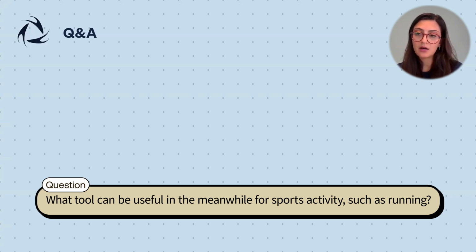The same protocol is also valid for cycling. Someone was asking if it can be used for bicycles. So yes, you can use it in indoor cycling, and you can also measure the activity of the muscle while pedaling. You place the sensor on the pedal of your bike, and you're able to evaluate the muscle coordination during the bicycle exercises.